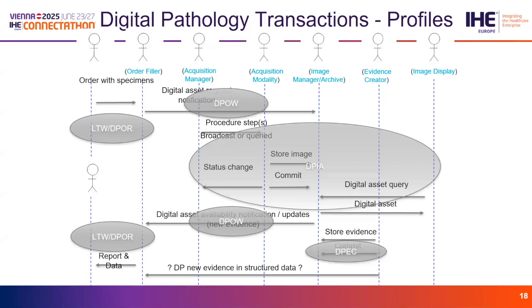Of course, there's more transactions that need to be supported in order to facilitate the acquisition manager actually getting that information, and other workflows such as announcement of the availability of a new digital asset. And that's where DPOW comes in, digital pathology ordering workflow, which speaks to interactions that were missing in order to support a digital pathology workflow with DPIA alone.